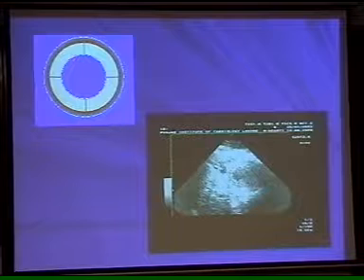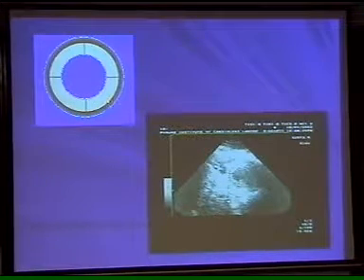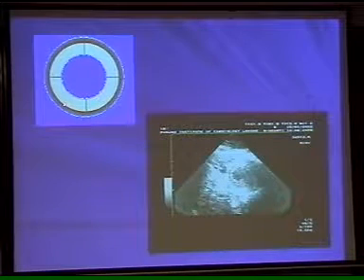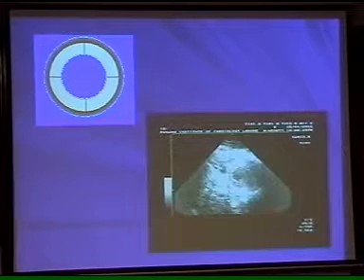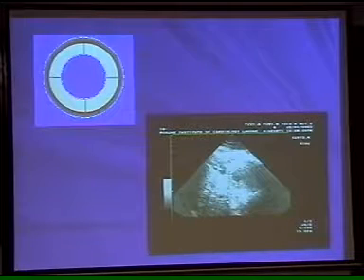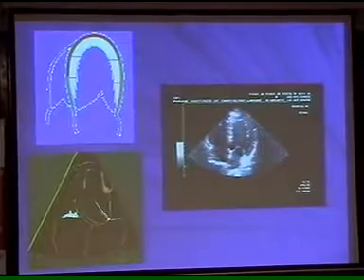So this is apical septum, anterior septum, and this is inferior, this is lateral and this is inferior. So this is all LAD territory. So if you find infarction or ischemia of the apex, then straight away you can say this is LAD involvement. And if different other segments are involved, you can go from segment to segment.